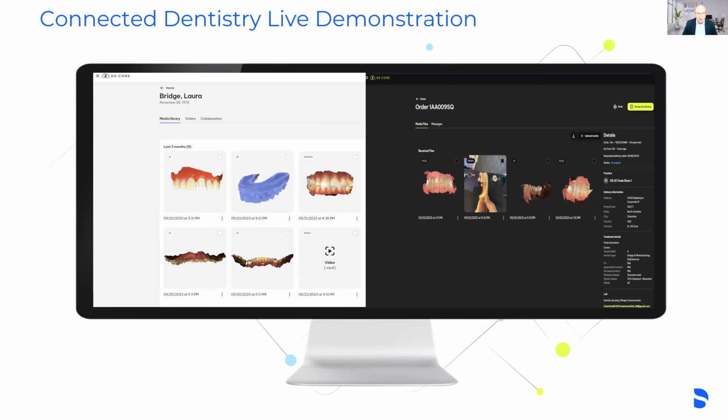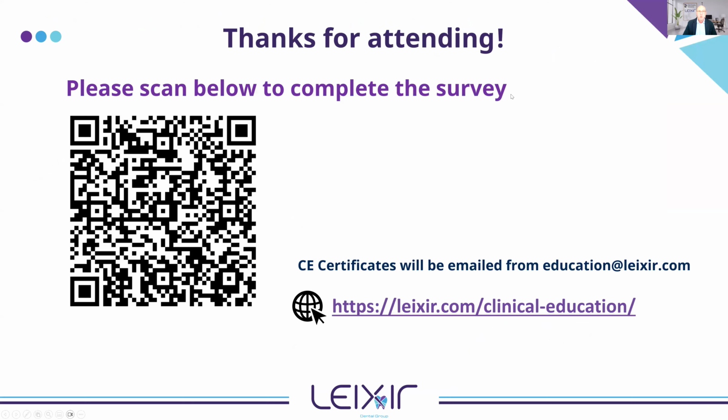So I am going to do a live demonstration of what this looks like within DS Core. We're going to do 3 different scan strategies. We're going to do a crown, and I'm going to show you exactly how that works all the way through ordering through the lab, and then also show a bridge case, and we'll do an implant case. So I'm going to go ahead and stop sharing right now.